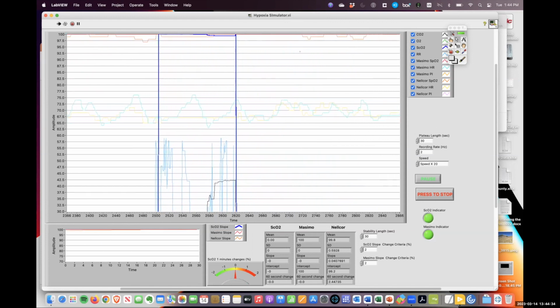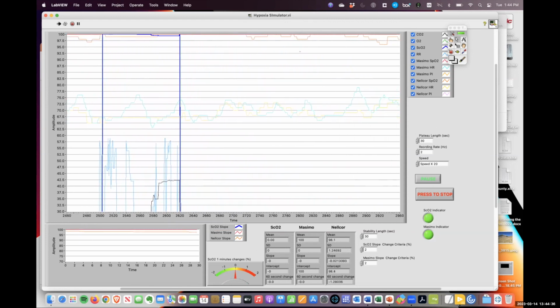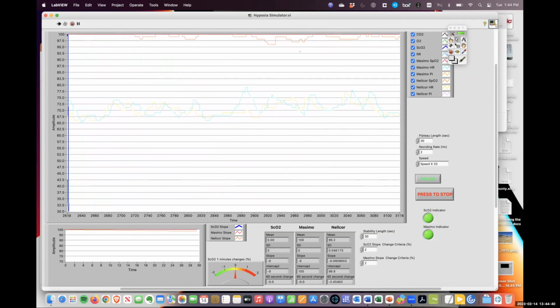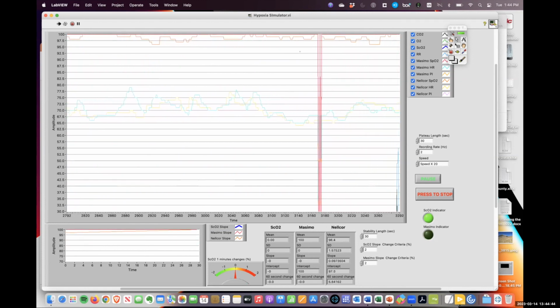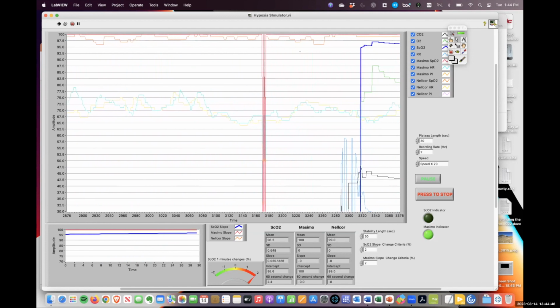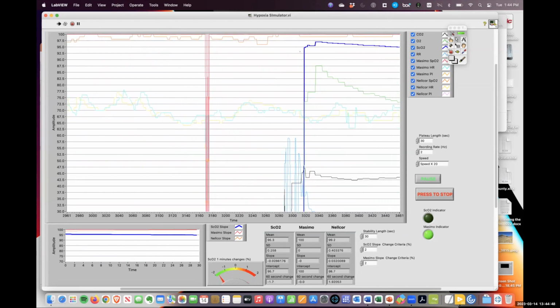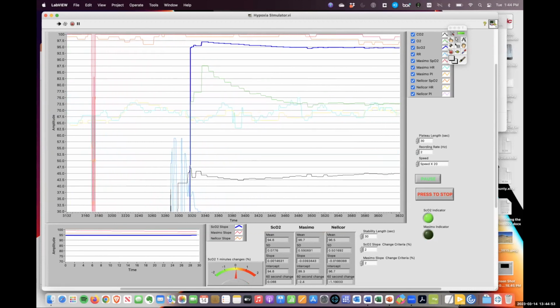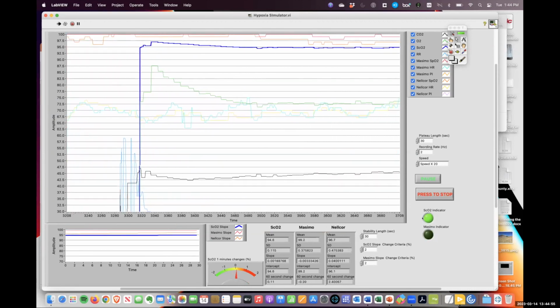Probably pretty good correlation between the heart rate response and the ventilatory response. And again, this is something we also talked about when we published this whole issue of silent hypoxemia, it really relates to the normal variability of responses. And again, this is just a very good example. Still working on the red line, green line here.